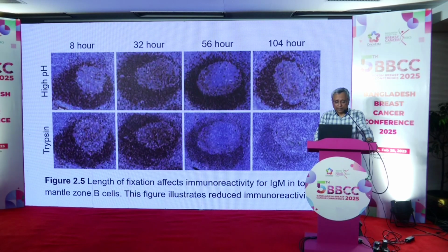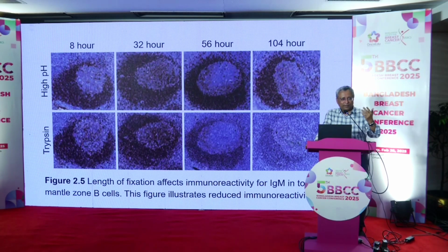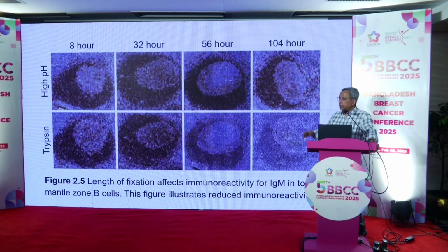Okay, so this is fixation time. Sometimes we fix tissue over the weekend or over a long weekend, 4 days, 5 days, thinking that it's in formalin, so nothing can go wrong. But actually, for immunostain, it can affect the performance of the assay. If you look at this 8 hours versus 56 versus 104 hours, look at the difference between the pictures. There's a lot of variation here.